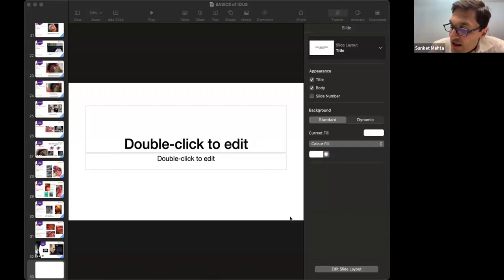It's used for a screening process when the liver is not mobilized. Sometimes you open the abdomen and you're not very sure about operability, so you would do just a basic screening without trying to mobilize the liver. If you feel that surgery is not to be conducted, you can abort without mobilizing the liver or doing too much damage. It's also helpful in certain patients where the diaphragm is invaded by the tumor and you cannot mobilize the liver well. There, I think the convex probe with lower frequency and therefore a higher depth of penetration is useful.